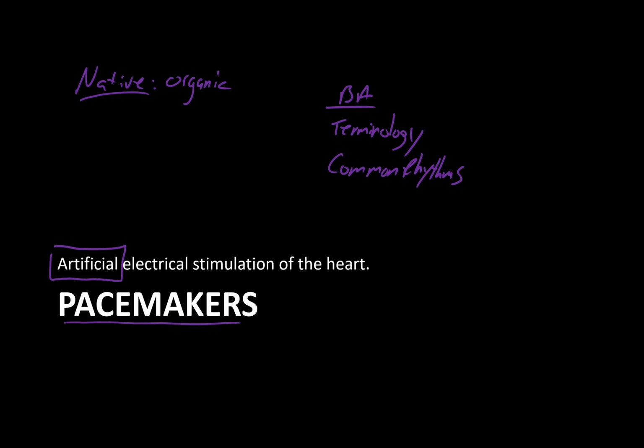So we'll talk a lot about those, and then there's a few other specialty items I do at least want to touch on, because this is a great place to make you aware of some finer points on taking care of pacemaker patients and what to do in case of emergencies. As for the advanced arrhythmia group, it really is just diving deeper into each one of these items. Some extra terminology, the functions, and more importantly, the malfunctions.